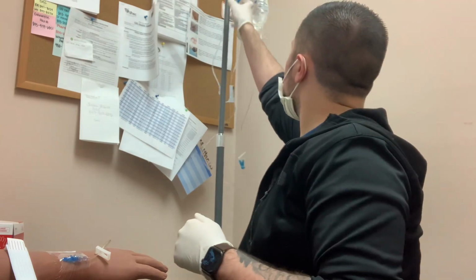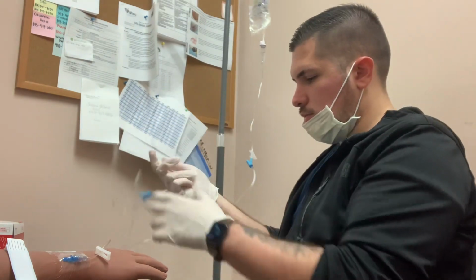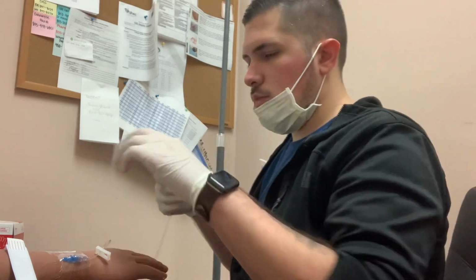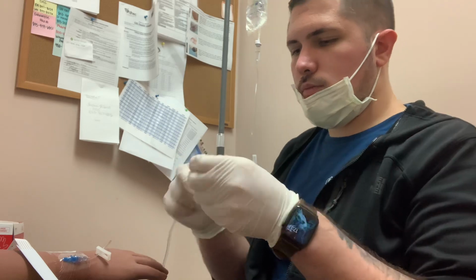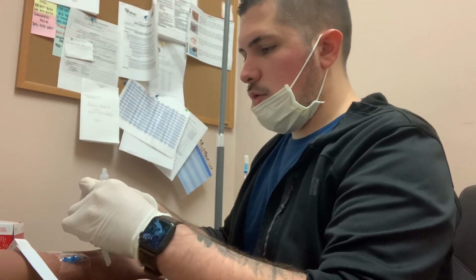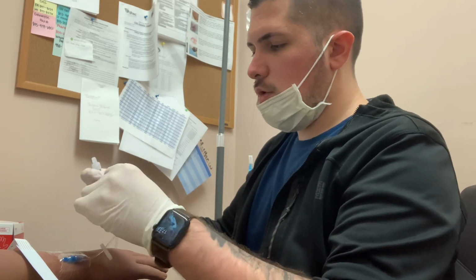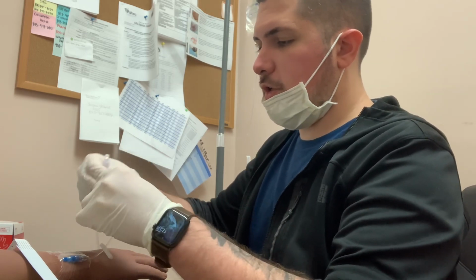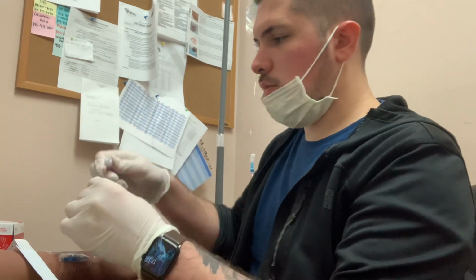Alright, so we will take our tubing with our alcohol wipe. We're going to scrub the hub vigorously. We're going to discard that.